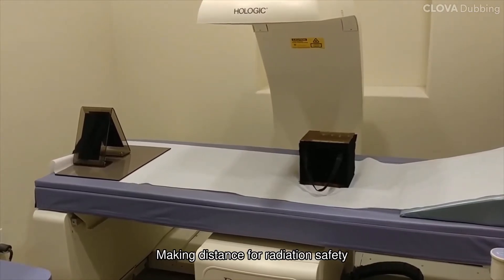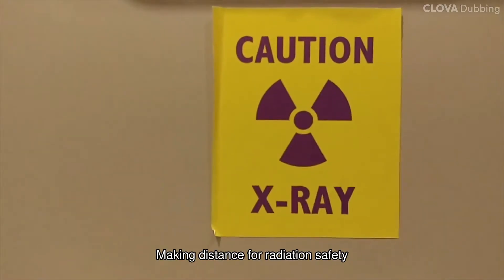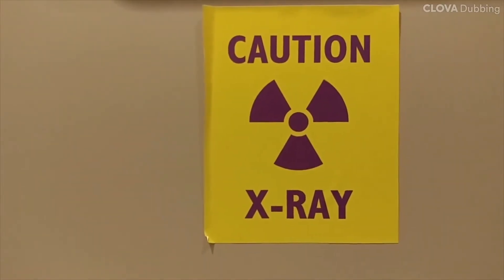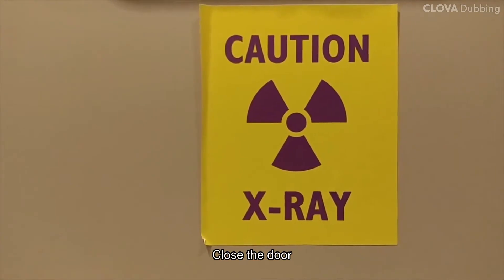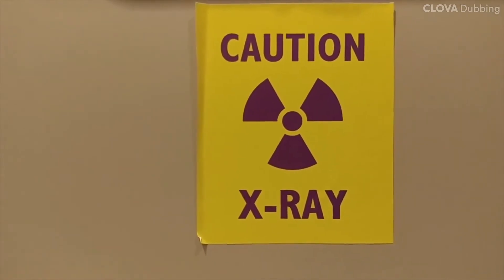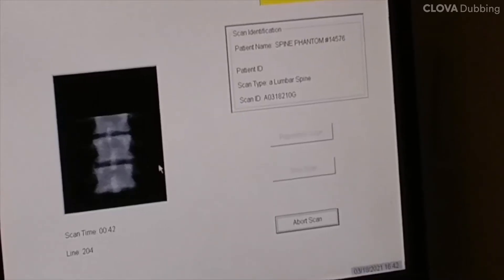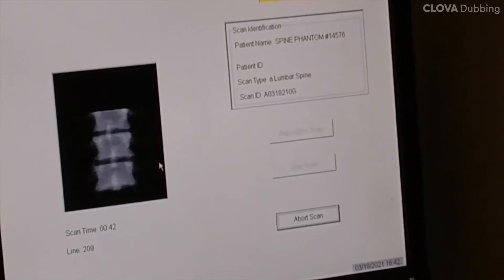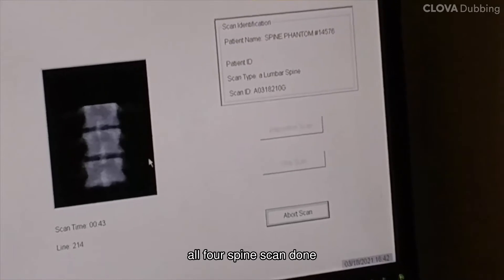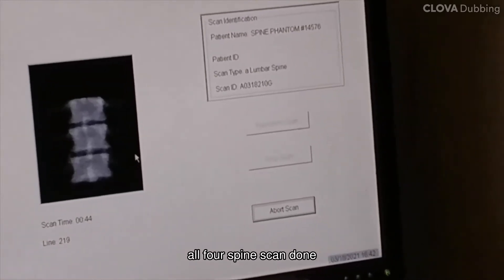Make distance for radiation safety and close the door. All four spines are scanned.